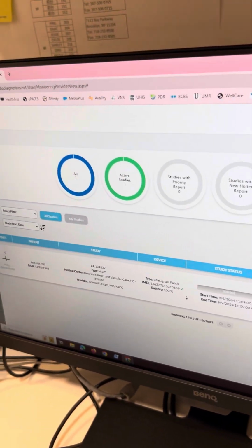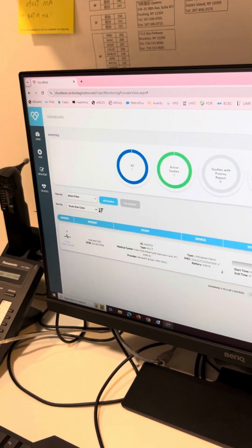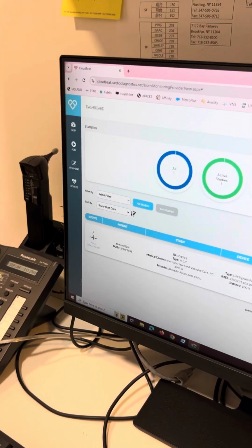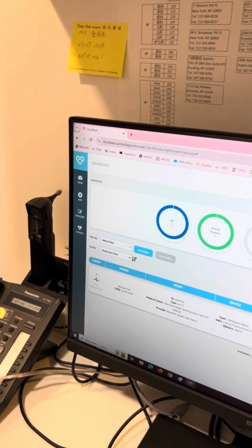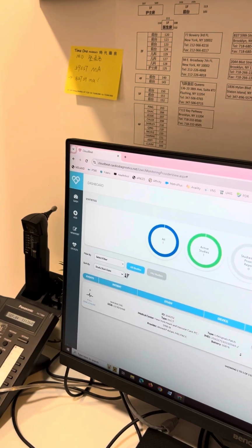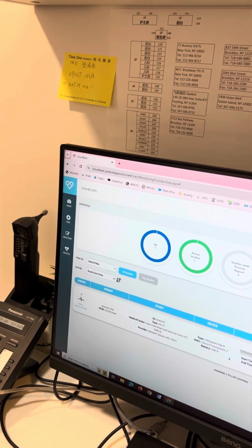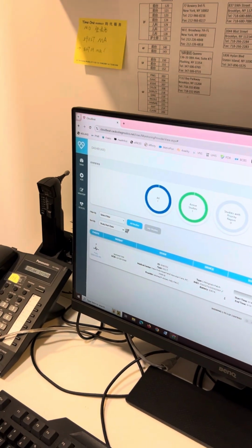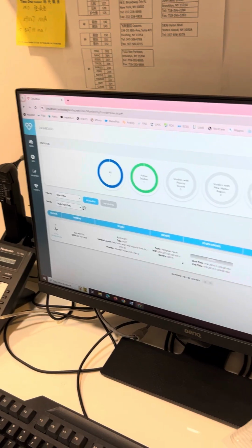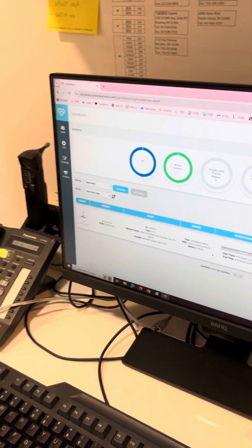From here on out, it's really up to my team to make sure that it transmits for the whole 5 days. If there's any issues, we'll contact the patient via text. We don't speak Chinese, so if they only speak Chinese and they don't reply to the text, I may have to call you and have you call the patient. But we'll try and do it ourselves first, via texting, which is in Chinese, Mandarin. Sure, I think it's Mandarin. I got it. All right.